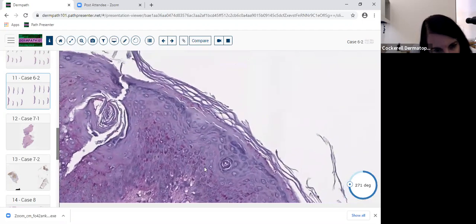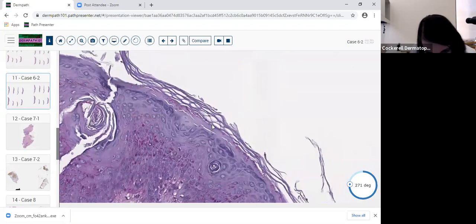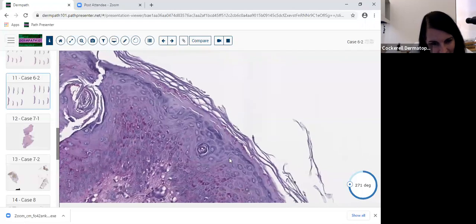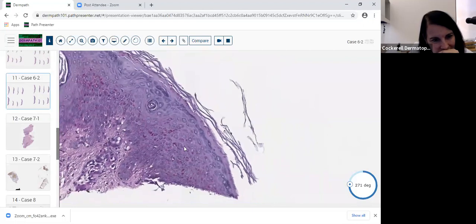All right, well, so we have the sandwich sign and we have the hyphae sandwiched in between the basket weave and the compact area. So this is the nice, beautiful sandwich sign with the hyphae. You see the septae, you see some branching. They don't look like pseudohyphae because they're more angled and not 90 degree. You'll see more 90 degree with Candida, and it'll start to move into the epidermis, whereas tinea doesn't. So tinea can include your epidermophyton, trichophyton, and microsporum organisms. They're staining very nicely here.